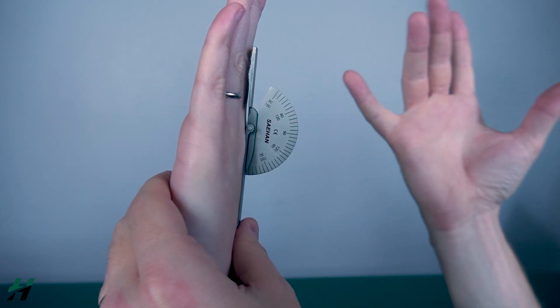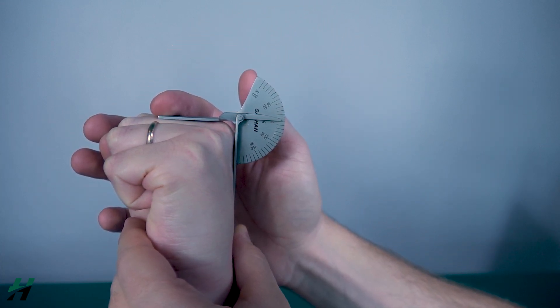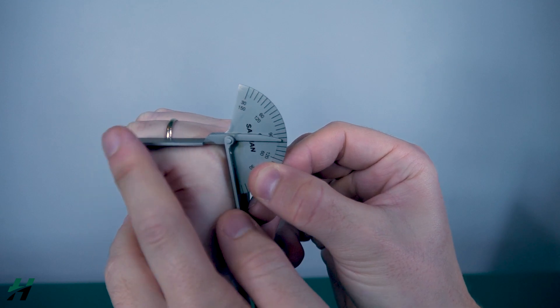Rachel, what I want you to do is curl up that hand for me as far as you can go. Right here we're looking at 90 degrees. You'll be doing that same process for all the MCP joints.